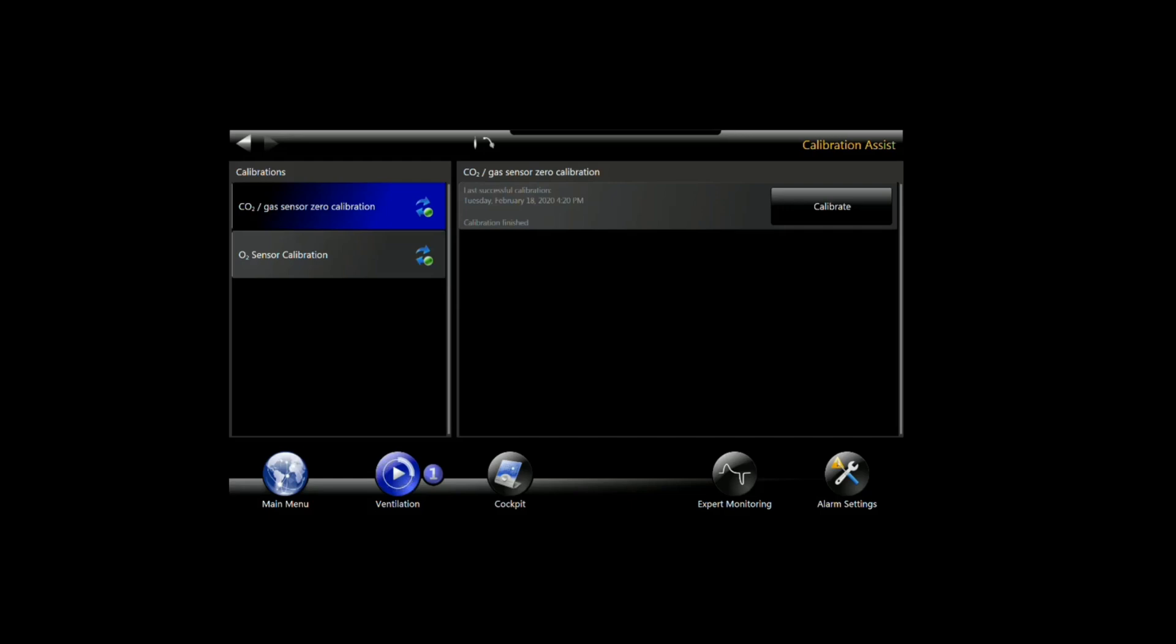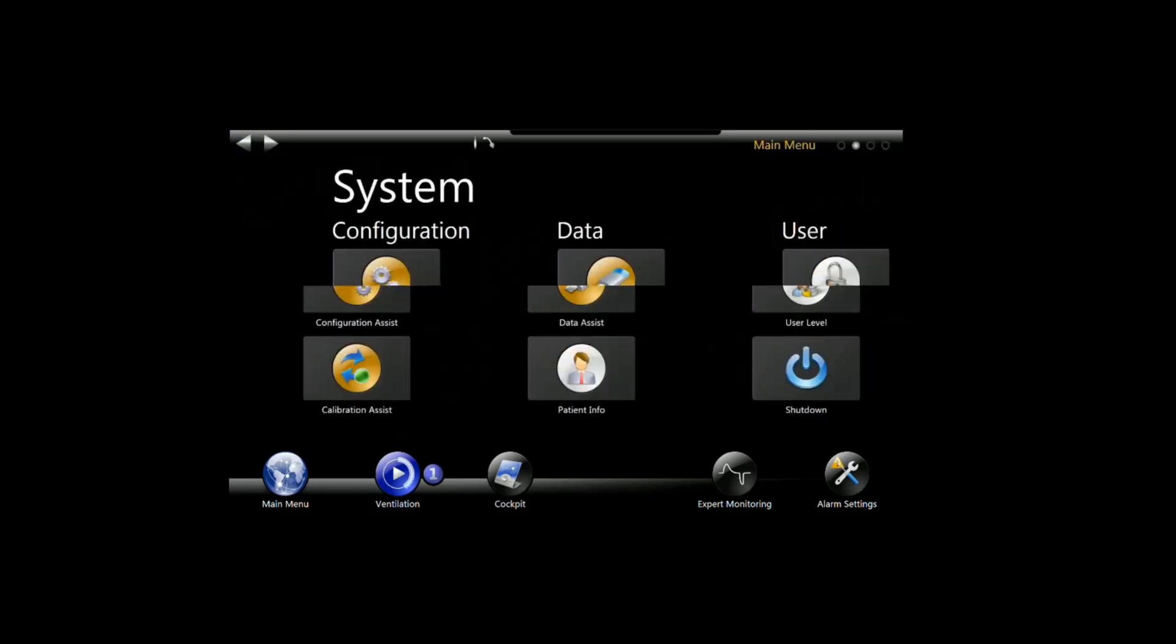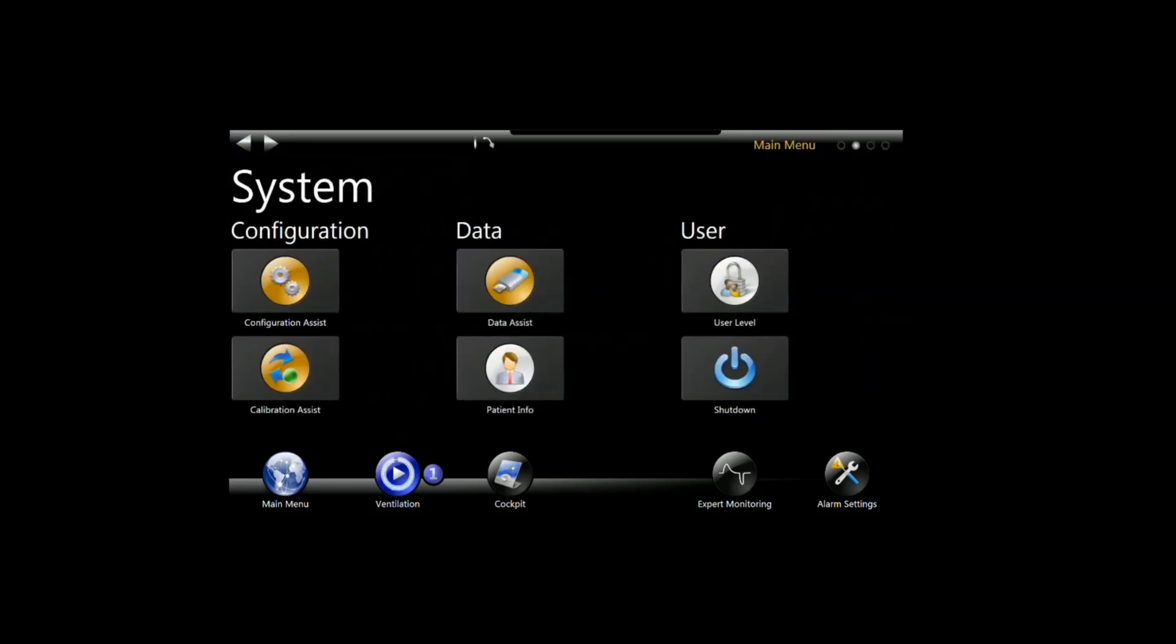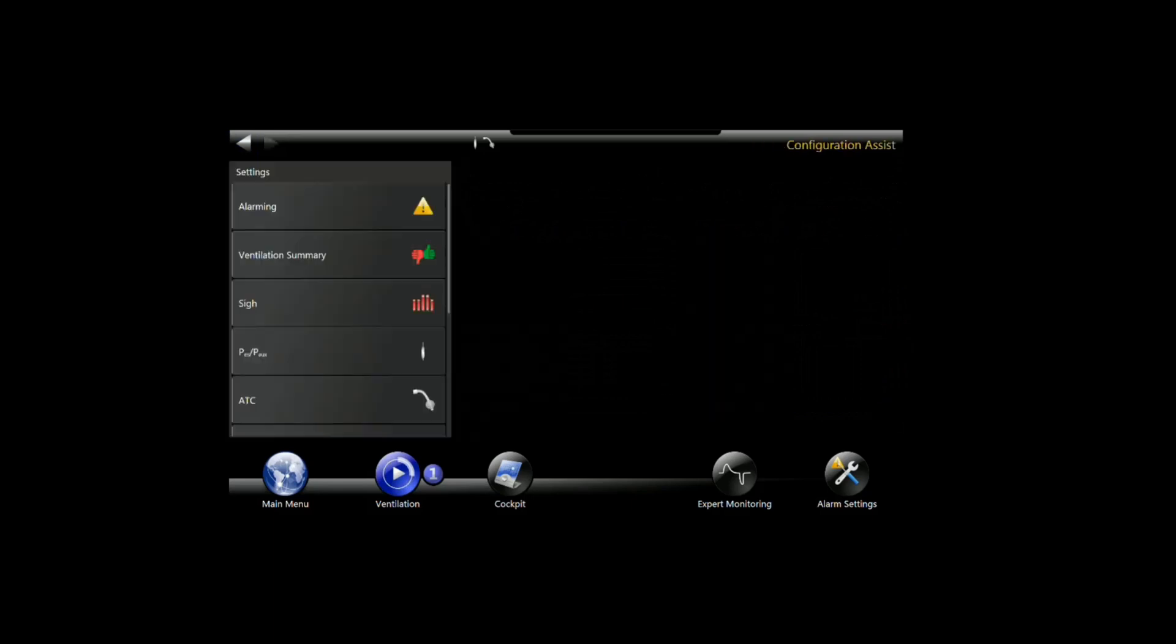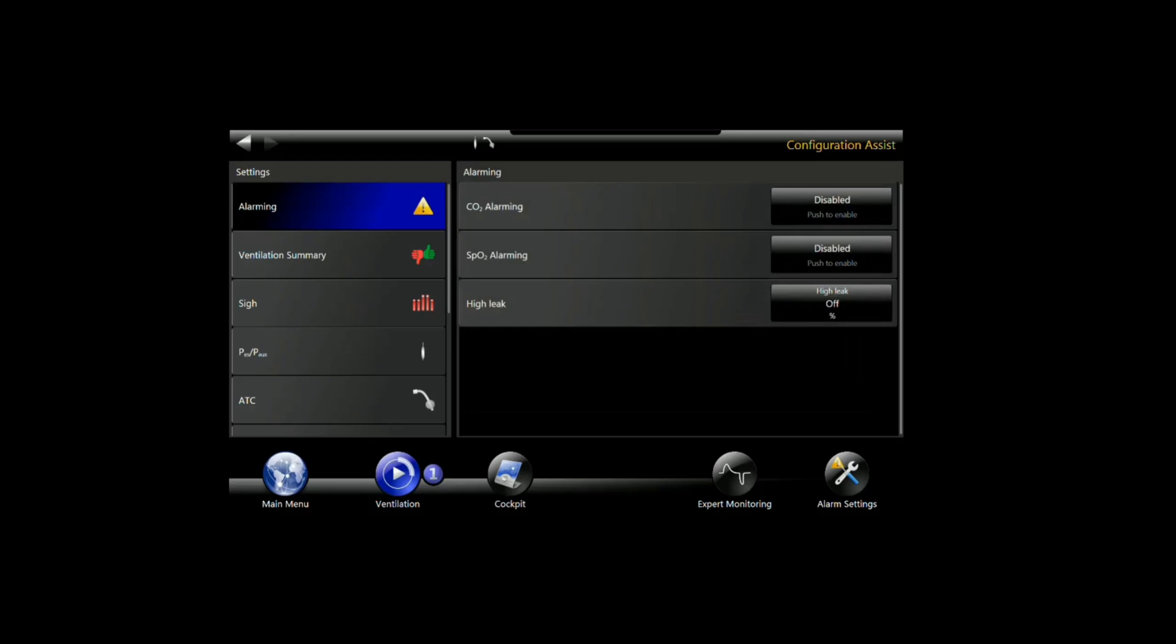We've finished that. While we're out here, let's go ahead and hit the back button at the top left hand corner. You'll see in the configuration assist screen that when we go to the alarming page, we have CO2 alarming is disabled.